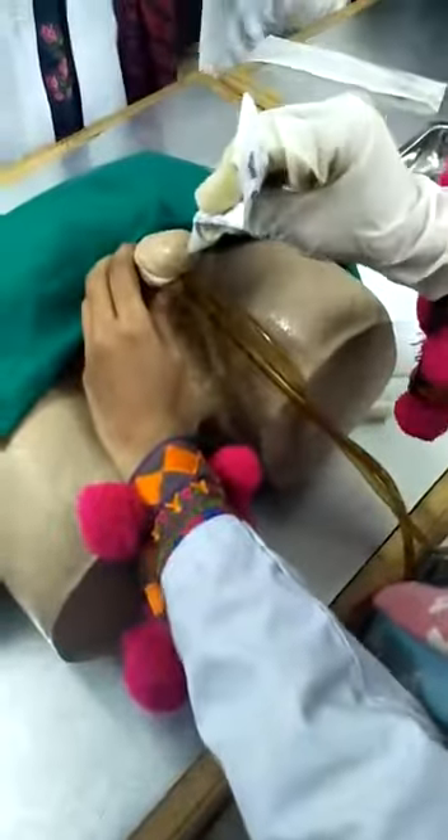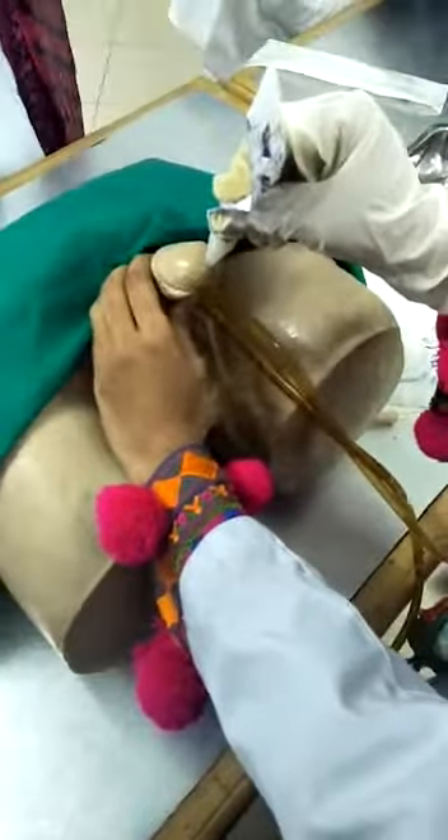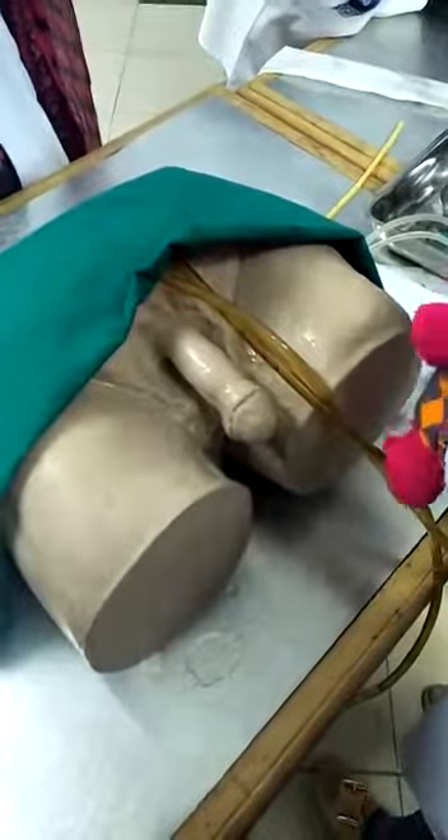Then start with the dilocaine gel to anesthetize the part. Apply almost half or three-fourth of the dilocaine directly to the penis. It has two effects: that is anesthetic and lubricant. Then apply the lubricant gel, or any gel that has a lubricating effect, on the catheter.